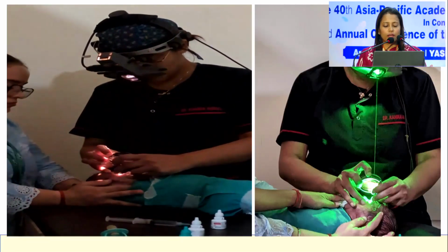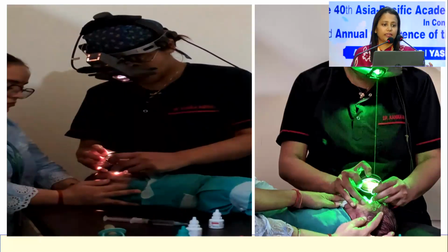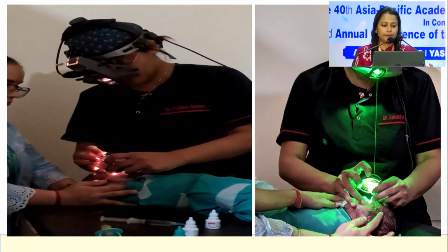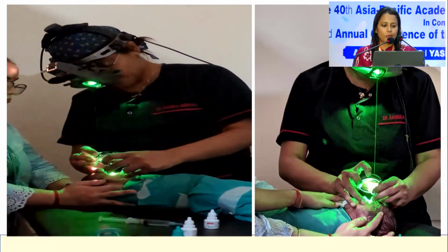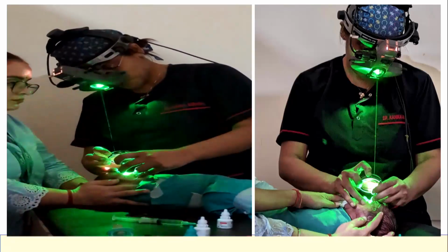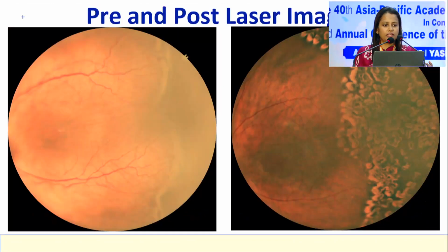We try not to anesthetize the child, but in case the child becomes a little bigger, then it gets very difficult to do it without anesthesia, then we are forced to do it. Okay, so these are the pre and post laser images.